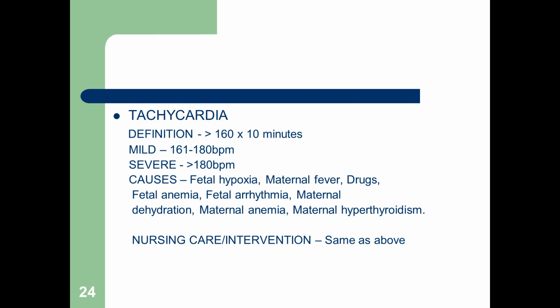Certainly, care and intervention is going to be change their position, administer oxygen, turn off the pit because we don't want to continue to overstimulate the uterus and keep this baby in distress. And certainly notify the physician, okay? Notify the physician.